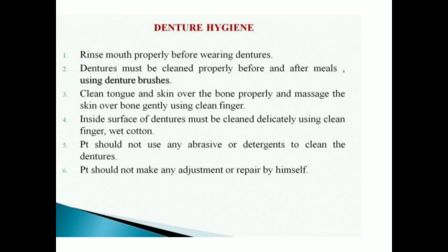The patient should not use any abrasives or detergents to clean the dentures. The patient should not make any adjustment or repair by himself. The inside surface of the dentures must be cleaned delicately using a clean finger and wet cotton, right? So all these denture hygiene instructions should be given by the dentist.